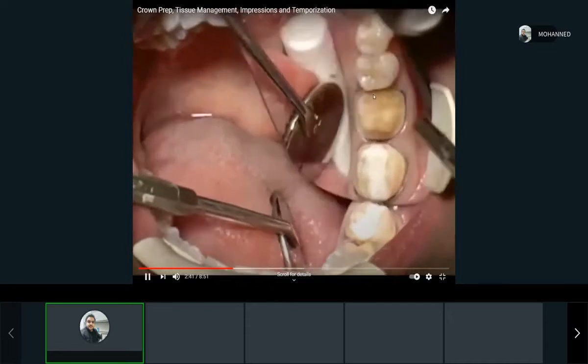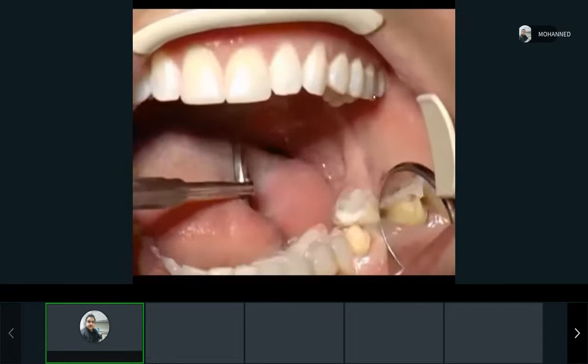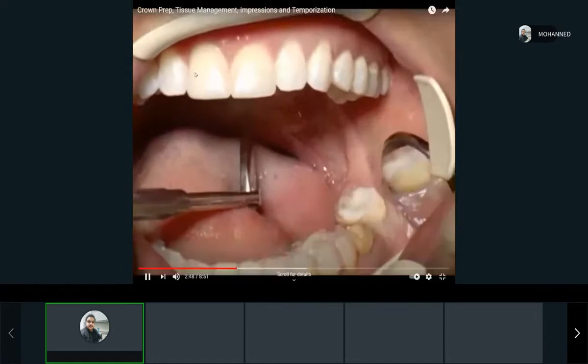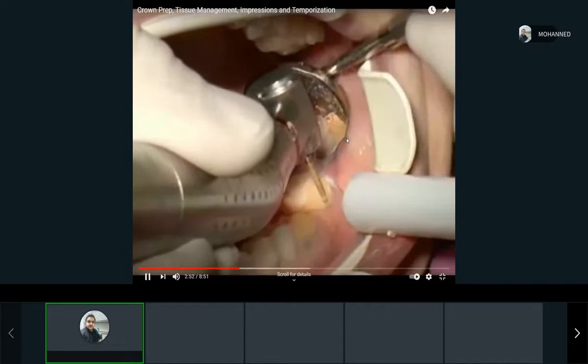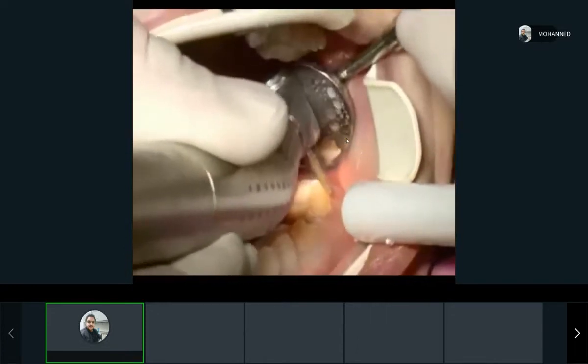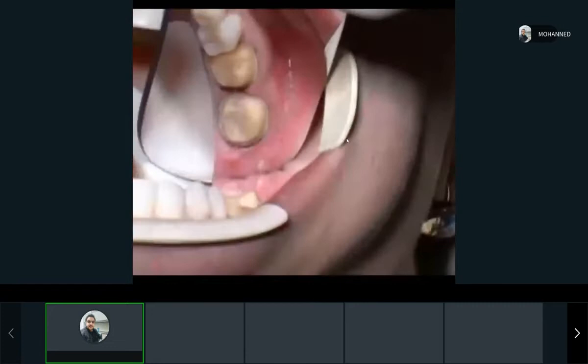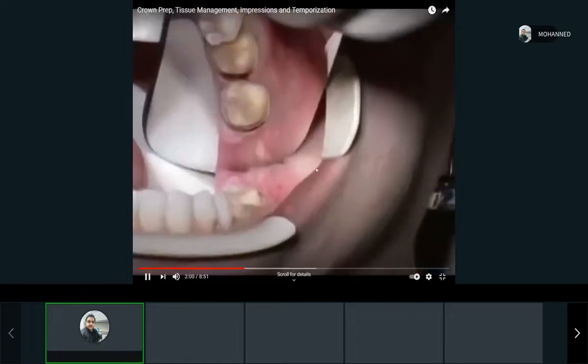In dentistry, one of our main enemies for our work is moisture, especially the saliva. And see, they're fighting the patient's tongue there. You'll see, yeah, your hand will get tired of the tongue. It's really strong. See, now we got a really nice edge all around the tooth there and all around that other tooth.